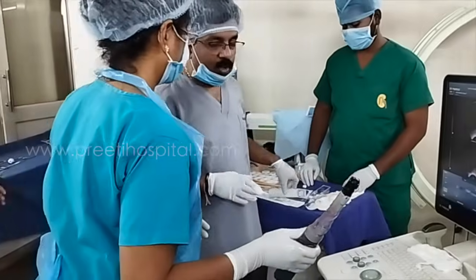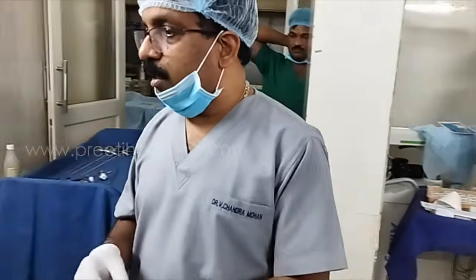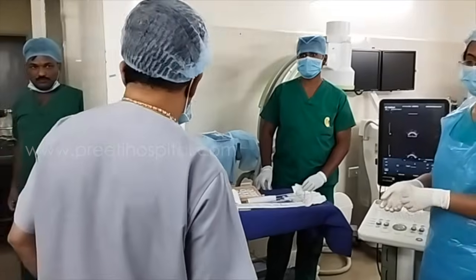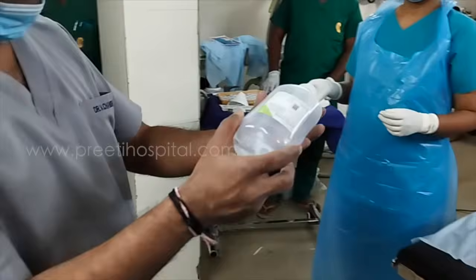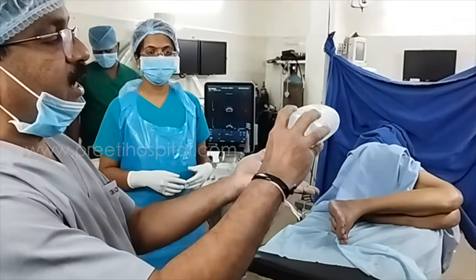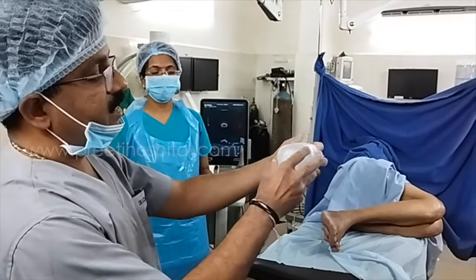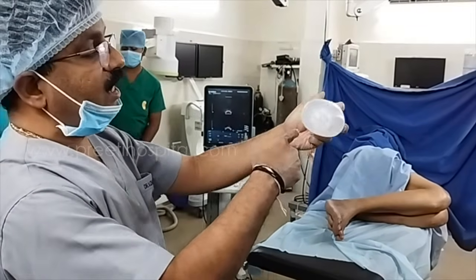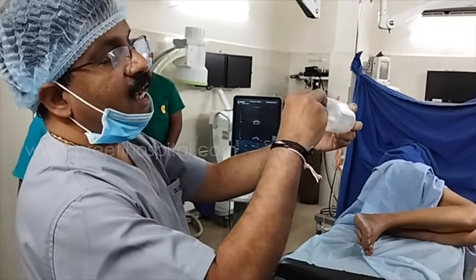So with this, we want to conclude. What is the important aspect we can see? If this is the prostate, what we have done now is, see, first this is the prostate. If it is right, if it is left, this is anterior, this is posterior. This is the base, this is the apex. So we are traveling posteriorly, base like this in sagittal, and base like this, and base like this, base like this. Whereas when it comes to here, there is no periphery.